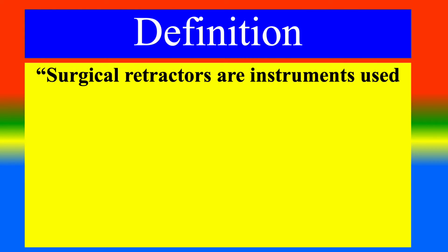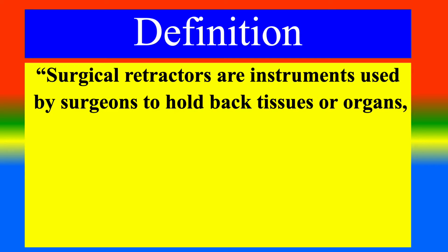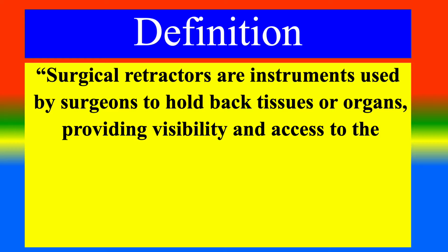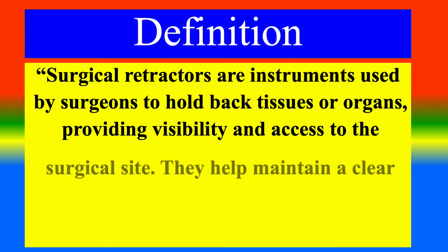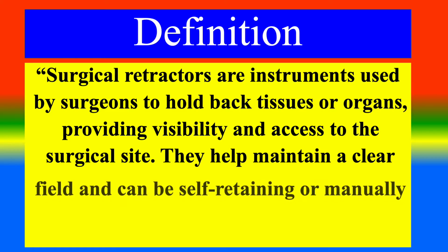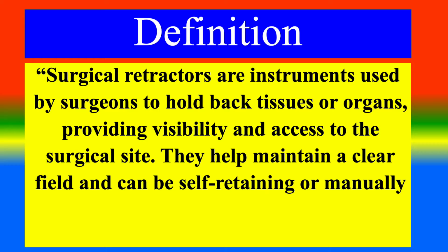Definition: surgical retractors are instruments used by surgeons to hold back tissues or organs, providing visibility and access to the surgical site. They help maintain a clear field and can be self-retaining or manually held.